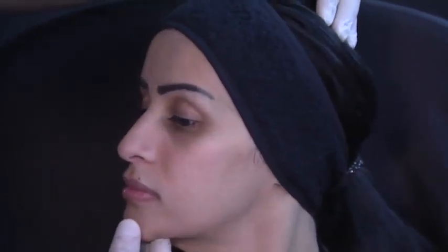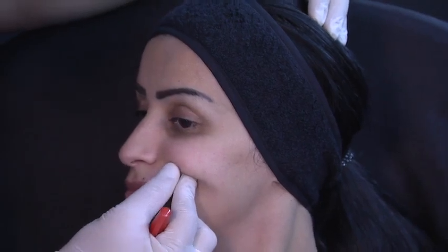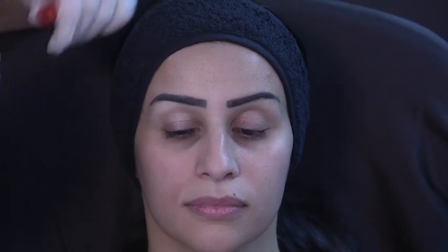If I treat her with a volumizer, I am going to over-treat this area, and she's not going to look natural. So going back to the way to decide the product, does she need a lot of volume? No. So volume is finished. Does she need a lot of lifting or projection because she has a lot of saggy skin? No. So lift is finished. My product of choice here is going to be Restylane Define, the versatile product. It's going to give me a little bit of volume, it's going to give me a nice projection, a very elegant cheekbone, and I don't have to over volumize her.